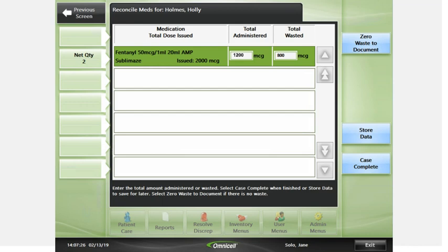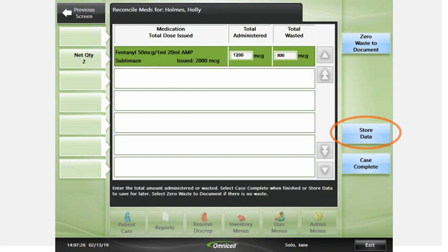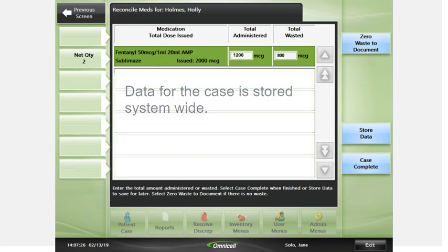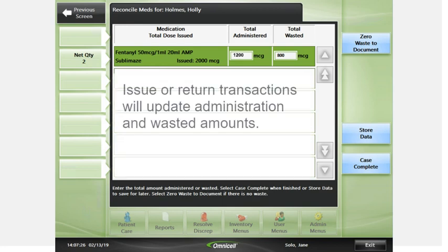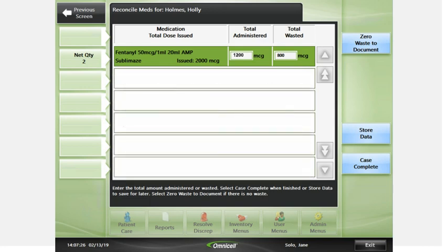If you administered the total amount for all items used during the case, press Zero Waste to document. If you are not ready to complete the case now, press Store Data. You can return later to complete the case. Data for the case is stored system-wide. Any issue or return transaction performed on the case after it has been stored will update the administration and wasted amounts. If you are ready to complete the case, press Case Complete.